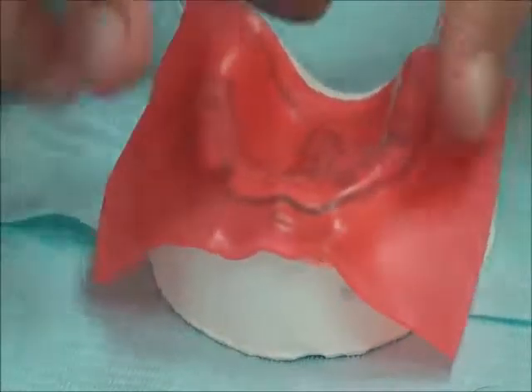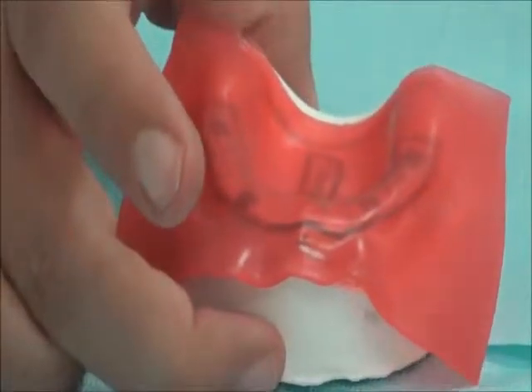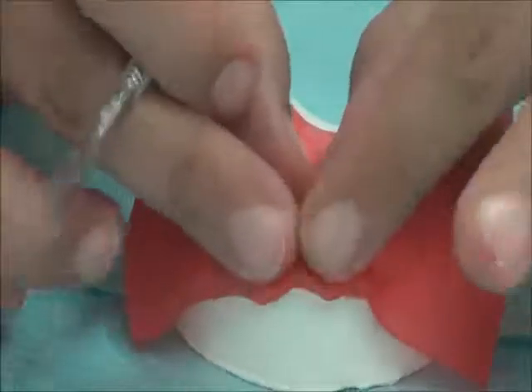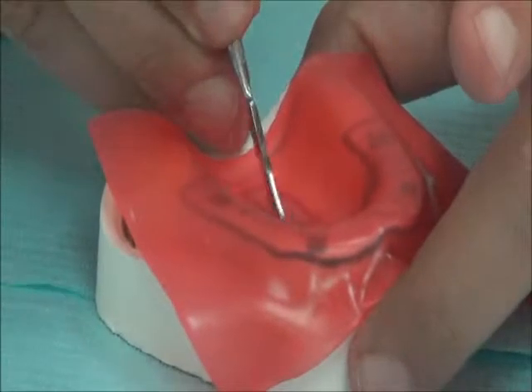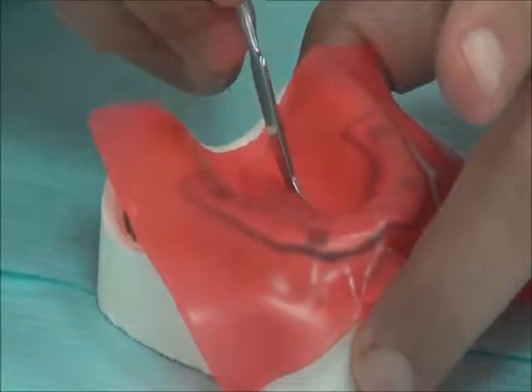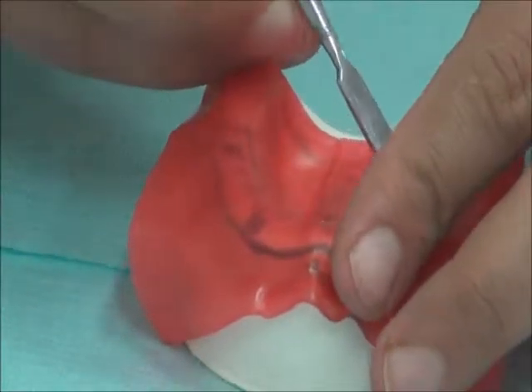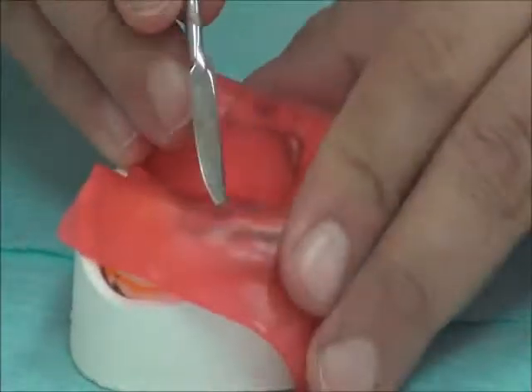And now, because I have drawn on the cast using a dark marker, I could see through it. Now I can use my lacquer carver and begin cutting off the wax in the areas that I am intending to leave exposed for the tray to come in and touch. The areas of the wax are maintained. So follow the outline that I have drawn.